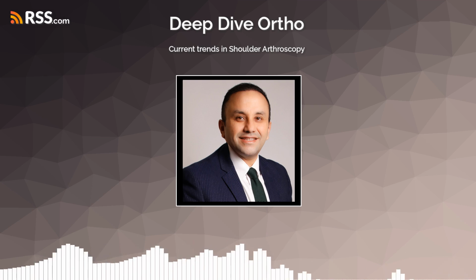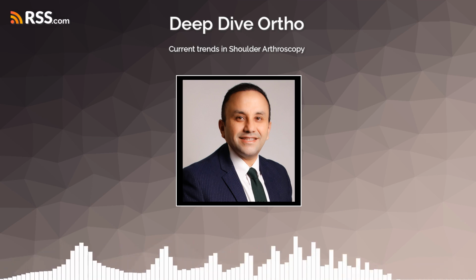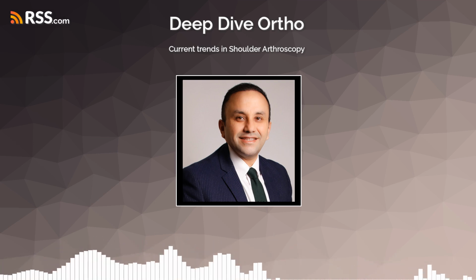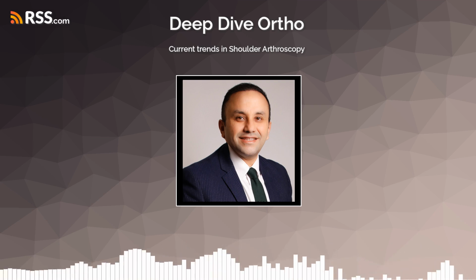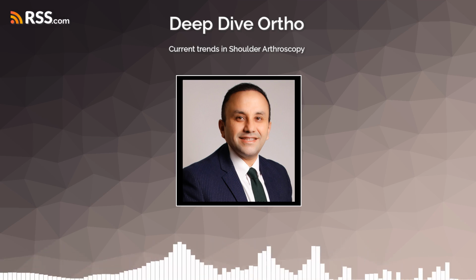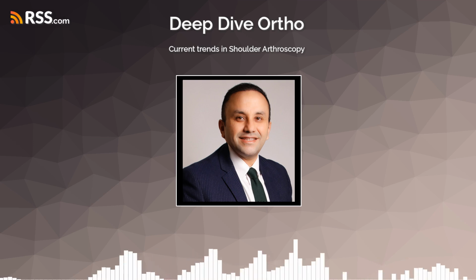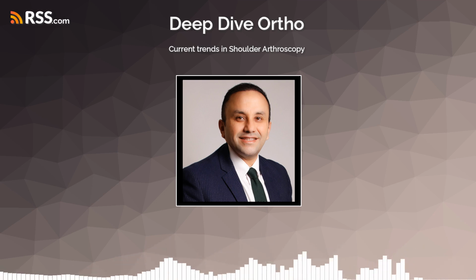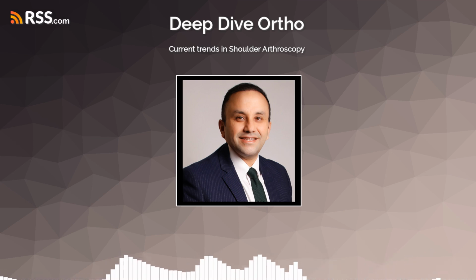Okay. Dislocations of the acromioclavicular joint, the AC joint, where your collarbone separates from your shoulder blade, are common injuries, especially in sports. How are those treated arthroscopically? Arthroscopic-assisted reduction and fixation techniques are increasingly used to treat the more severe ACJ dislocations, the ones where the clavicle is significantly elevated. How is it fixed? These techniques often involve using strong sutures or tapes, like the commercially available TightRope and fiber tape systems, passed around the coracoid process and through or around the clavicle to pull the clavicle back down into its correct position relative to the acromion, and then secure it there while the ligaments heal.